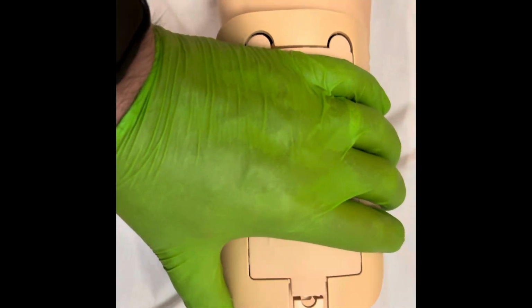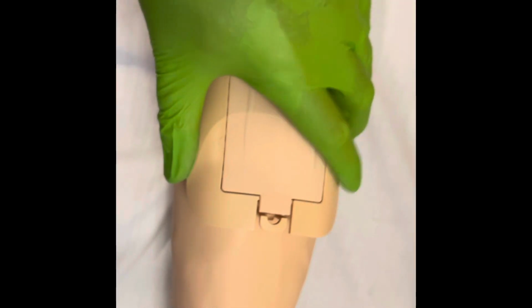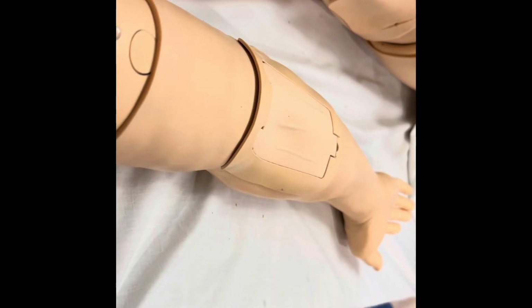So make sure that your skin is aligned, and then go ahead and put this IV pad to the top first, and then click down here. And I can't do it one-handed, so I've got to, there we go, got it. Heard that nice click there.